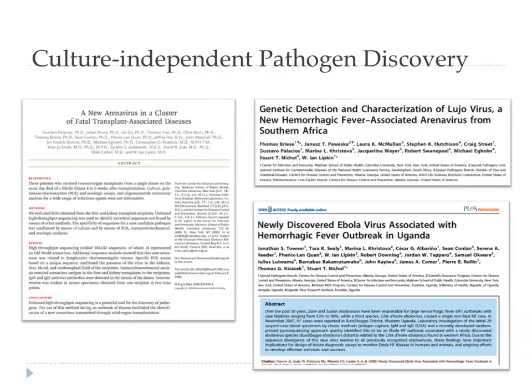So over the last few years, a couple of years now, there have been a number of papers showing proof of principle in this area. As I say, virologists are always the first off the block, and there have been a number of examples where they've done high-throughput sequencing in a completely unbiased way, just taken cDNA from patients and from tissues where it was unclear what was going on, clear that the patients were sick and that there was an infection but didn't know what the cause was, and identified new viral causes and new kinds of virus that had not been described before.